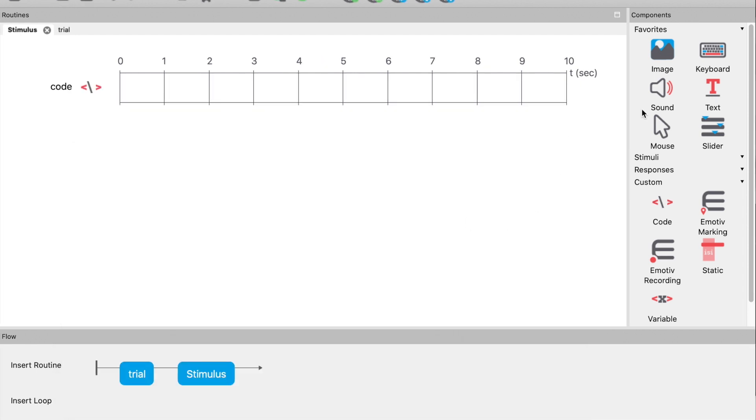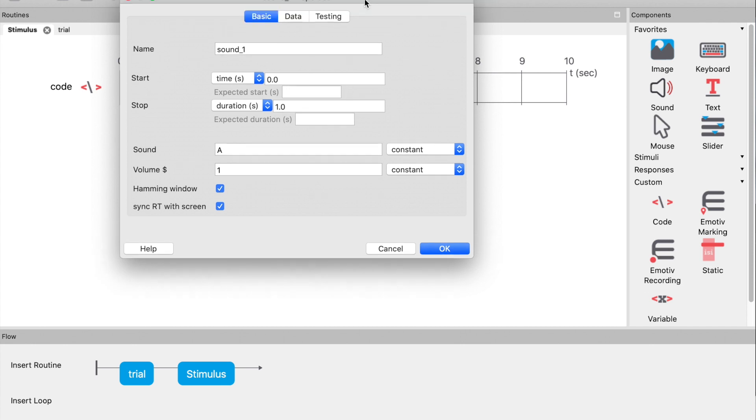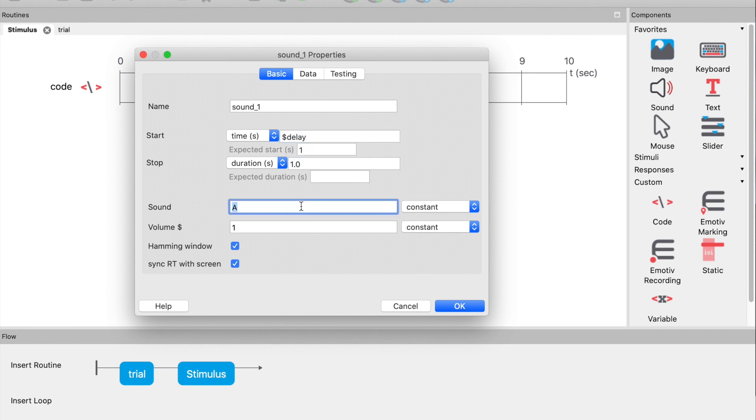Now let's add a sound component. Set the start time to be $delay and the sound tone to be $tone. These will have been set by the code component that we have just added.